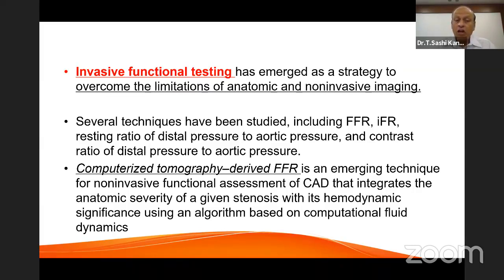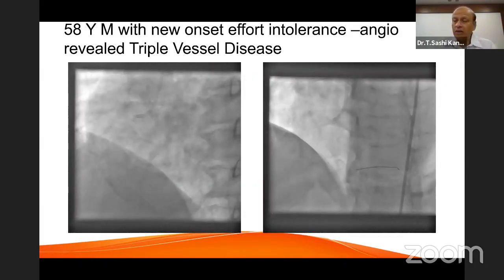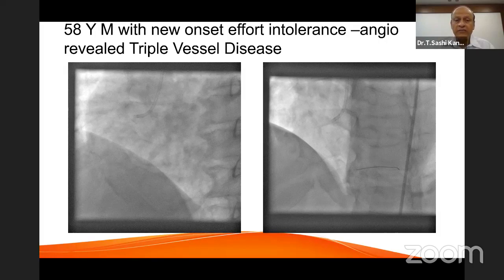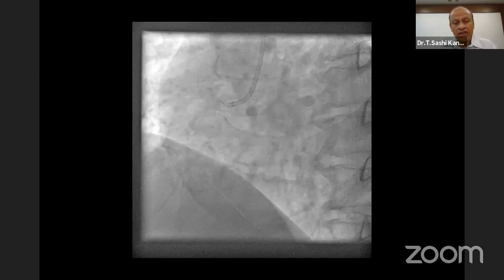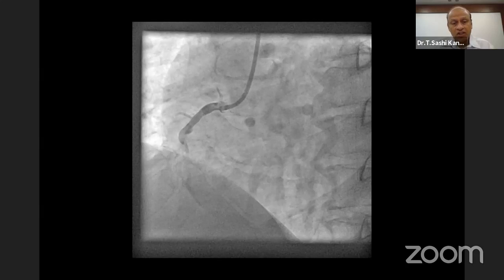Let's look at the example of a 58-year-old male recently referred with new-onset effort intolerance. His angiogram revealed triple vessel disease and he was advised bypass surgery at another hospital. On presentation, his angiogram showed the right coronary artery with a significant 60–70% stenosis in the distal vessel.